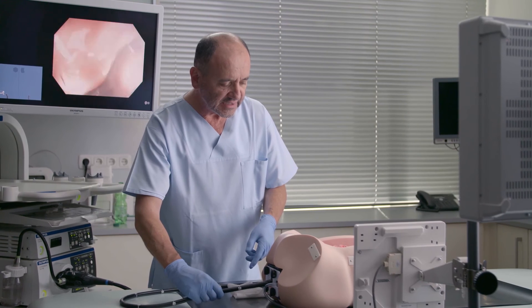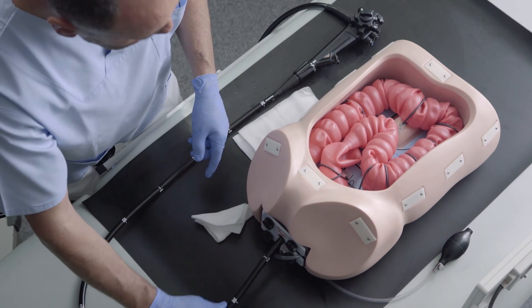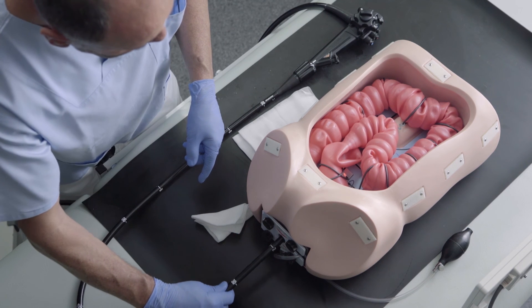Your right hand is like the walking stick of a blind man. It is the one with which you can feel the colon.